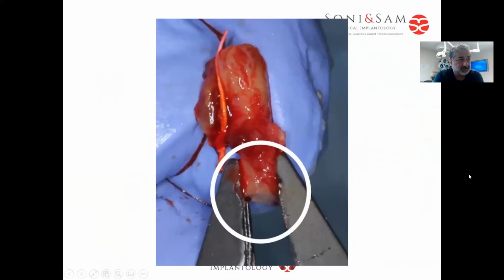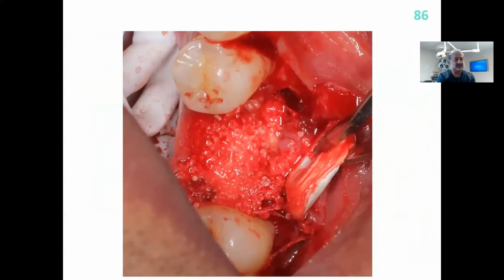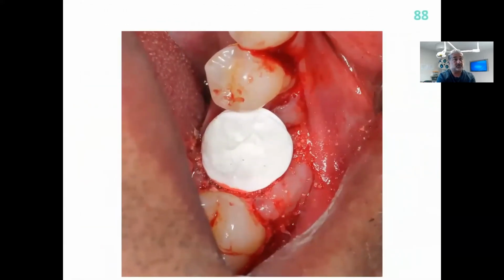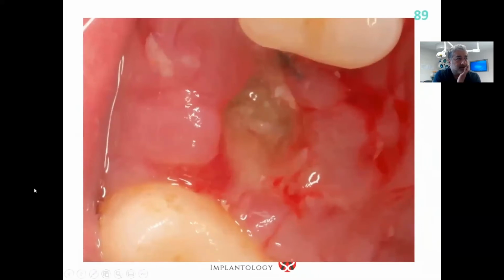And whenever I do that, it always does that. It was in the picture. I was more interested in taking the picture than actually checking. So practice what you preach, Dr. Soni, practice what you preach. So I had to take the collagen sponge, the Parasorb off, and take all the Ethos out. I had to put another bit of Ethos in there, so it cost me £100. And then I sutured that down.